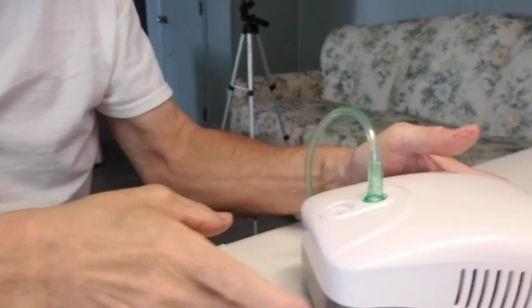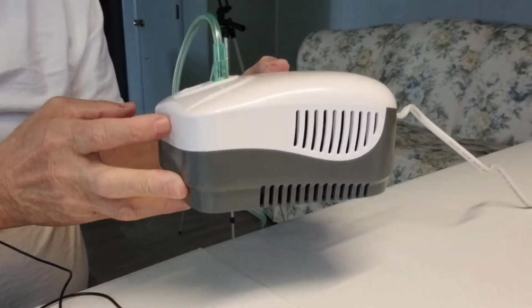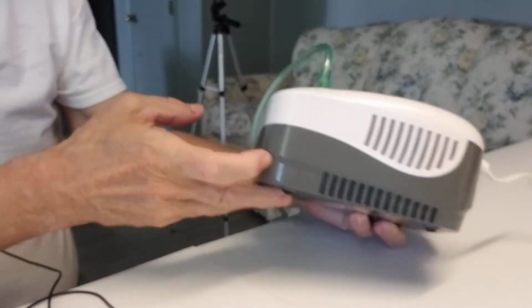Here is what a nebulizer looks like. I'm going to move this in the side here. This camera down a little bit. This, my friends, is a nebulizer machine. It's just a simple little box.